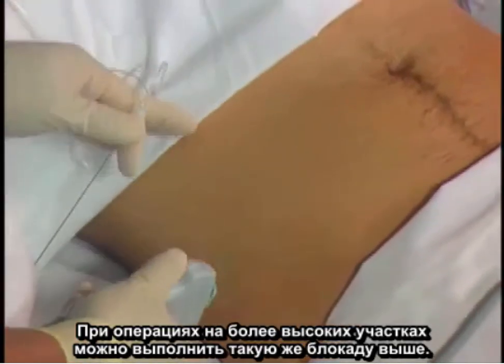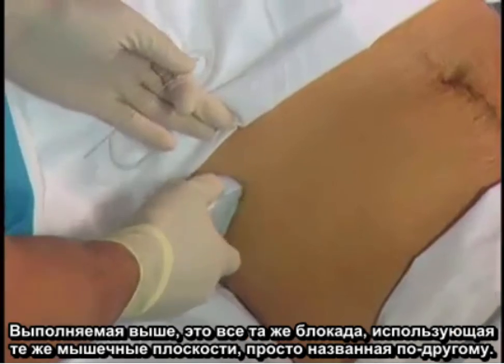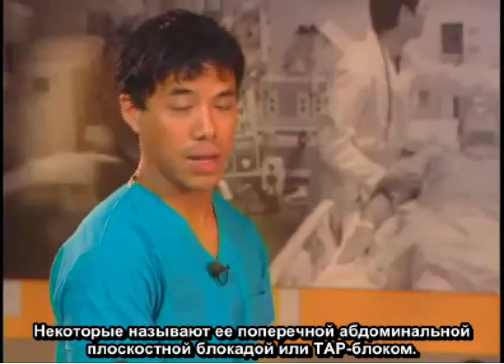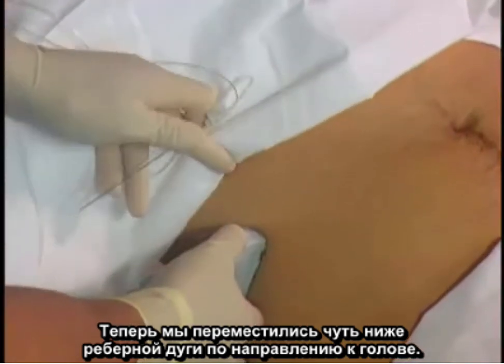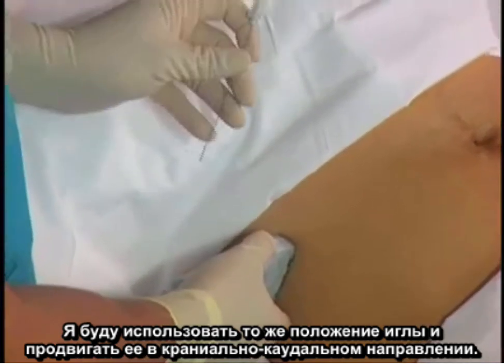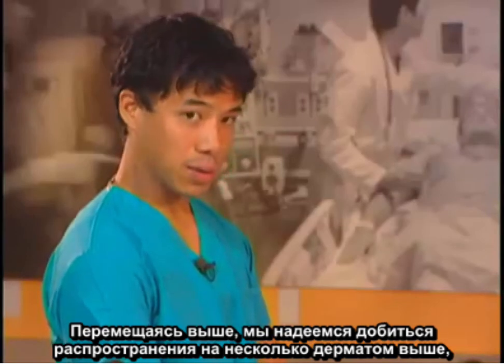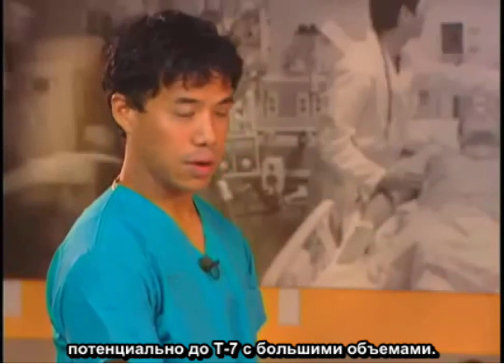For higher surgeries, you may want to perform the same block higher up. It's the same block using the same muscle planes, just given a different name — some people call this a transversus abdominus plane block, or TAP block. Here, we have moved just below the costal margin slightly cranially. I will use the same needle position and advance it cranial to caudal. By moving higher up, we hope to get spread a few dermatomes higher, potentially up to T7 with larger volumes.